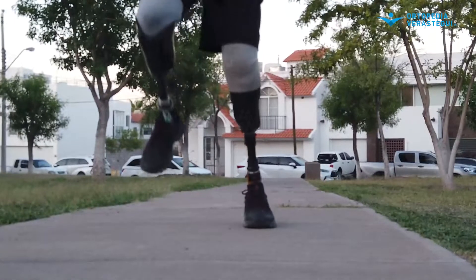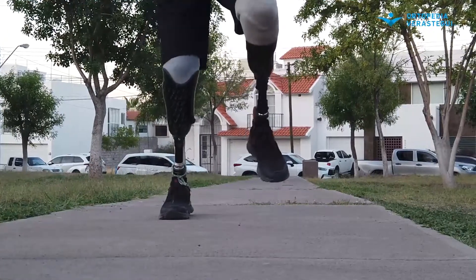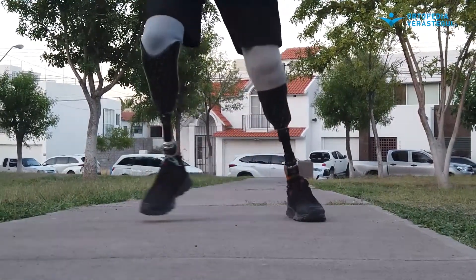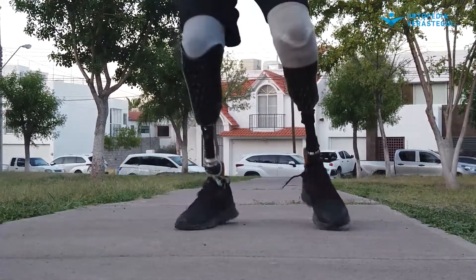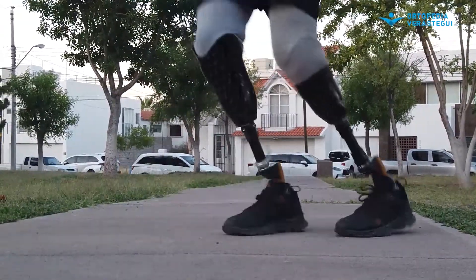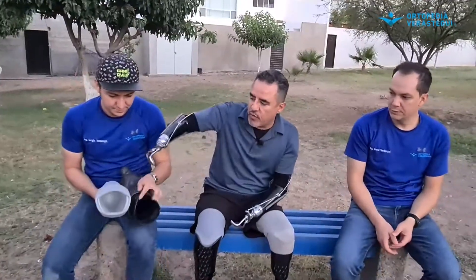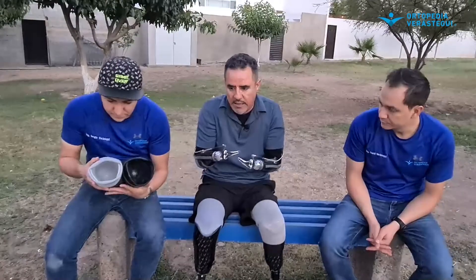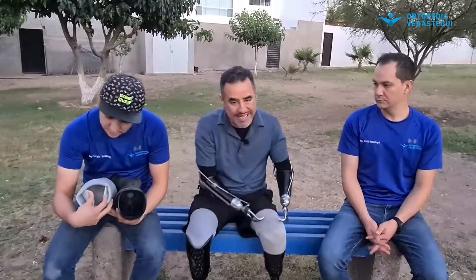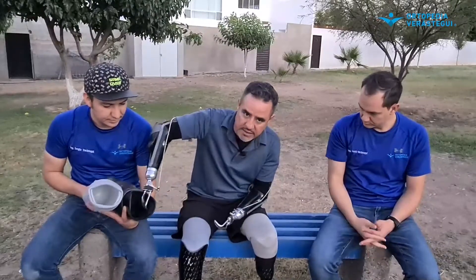Al traer doble válvula de vacío, necesitas meter menos peso, o lo haces el doble de rápido — es mucho más eficiente. Aparte el sistema One hace un mejor sello de vacío, por eso hay menor fuga comparado con otro. Otra gran ventaja es el socket interno que es flexible. El sistema One lleva este socket flexible, entonces ¿qué sientes cuando el muñón está en contacto directo con el socket flexible? De inicio sientes muy parecido, pero ya al tiempito, una o dos horas de uso o con mayor actividad, te da mucho más confort porque hace como un colchoncito.